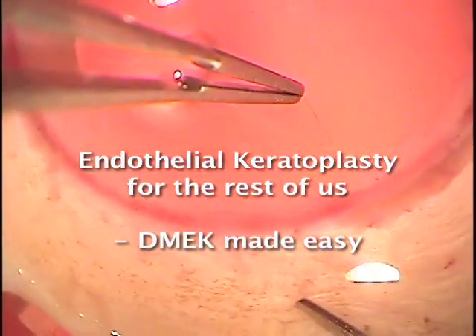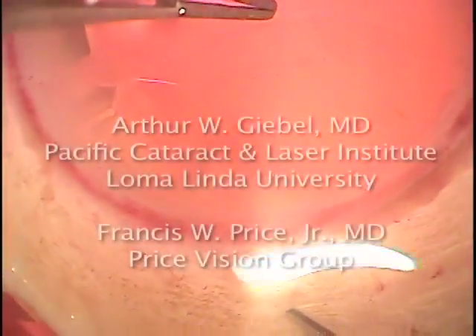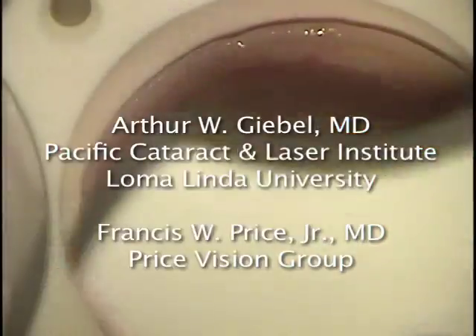Welcome to the world of Descemet's Membrane Endothelial Keratoplasty, a surgery that is beautiful because it is simple and affordable, so it can be done anywhere and it gets great results. Let's explore.